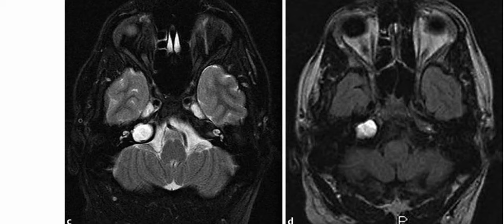On the FLAIR sequence, the lesion is also hyperintense. This lesion did not enhance on the post-contrast sequence (not shown). The lesion is hyperintense on T1, T2, and FLAIR sequences. The key finding is a petrous apex mass that is hyperintense on T1, T2, and FLAIR, and the diagnosis is cholesterol granuloma.